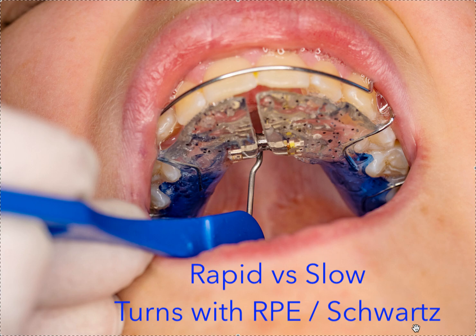Also, the other benefit was you wouldn't get that giant gap between the front teeth, which patients hate. And often when you're doing phase 1 or interceptive expansion, not comprehensive with braces, you may not even be putting on braces. You might not be doing phase 1 aligners. You might just be widening the arch. And if you go nice and slow, and the frequency I'm not going to get into because I have other videos on that, when to do what, which direction to do it, then you wouldn't get that giant gap, which is so not aesthetic. It just was really gradual, and slowly the teeth would just start to align on their own because they had more space and more freedom to move. And it's just real gentle, not as much discomfort.